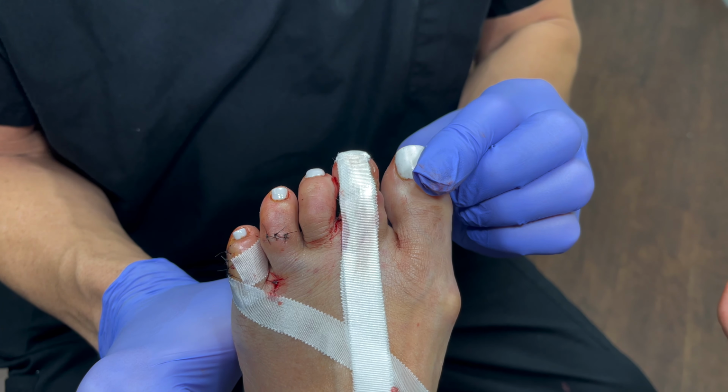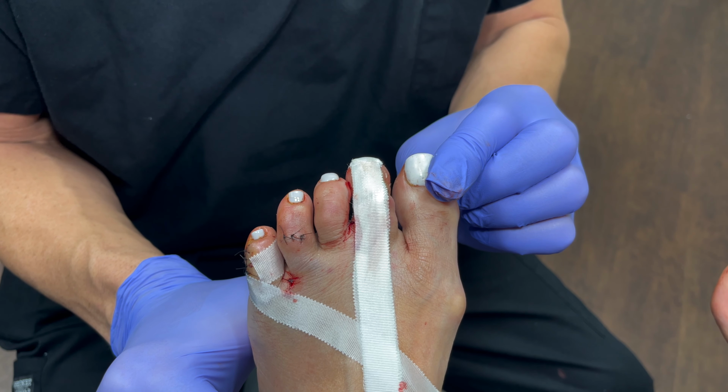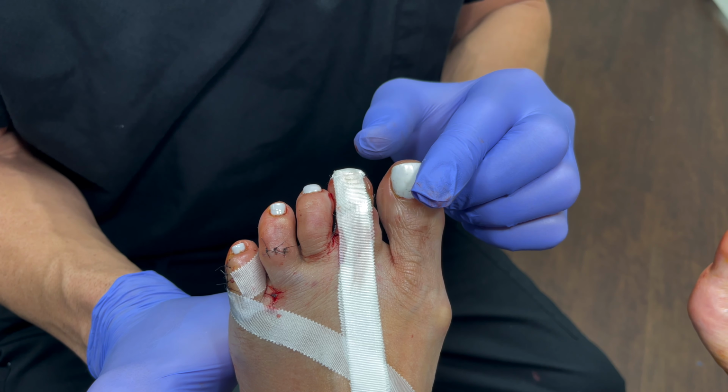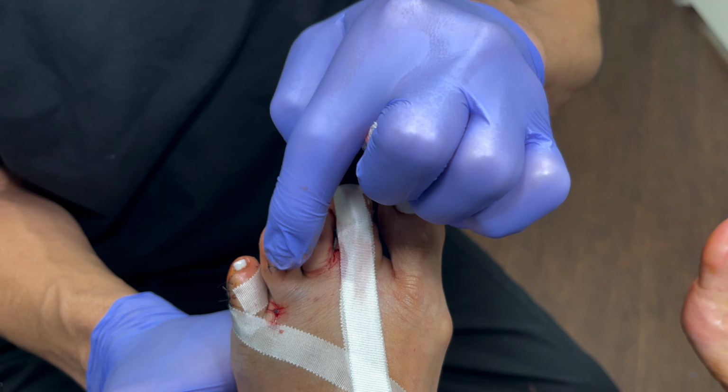So without further ado, let's take a look at the left foot first. As everyone can see, a very robust and dramatic transformation. The second toe has been shortened quite a bit, to say the least. The sutures here are where we excised the unsightly corns. Those are not very pretty. We are rotating now. Everyone can see that the toe is actually straight. Now we can see not only the nail on top. Before, it was curling underneath the fourth toe. It's what we call a little shrimp. So we have de-shrimped the toe, if that makes any sense.